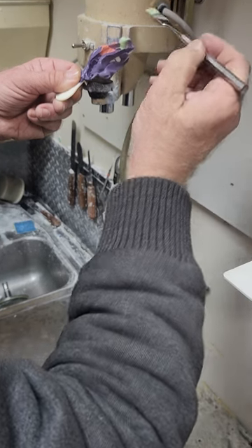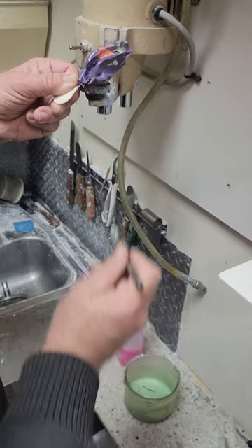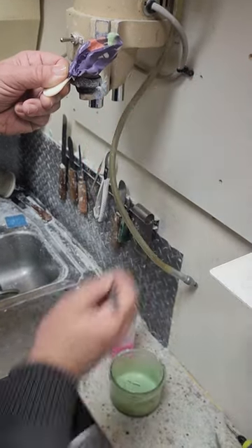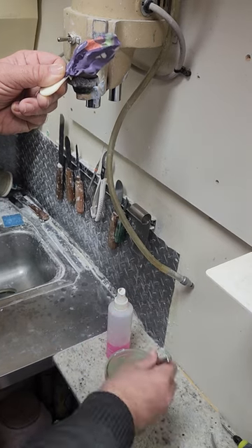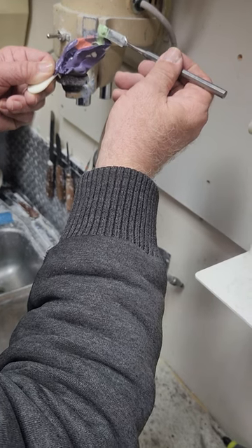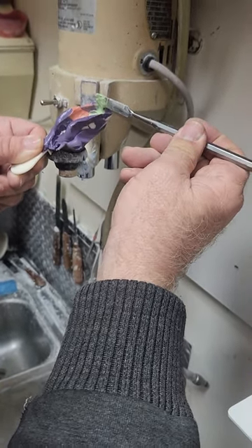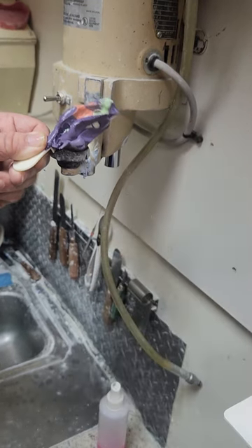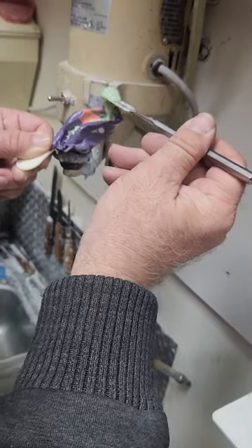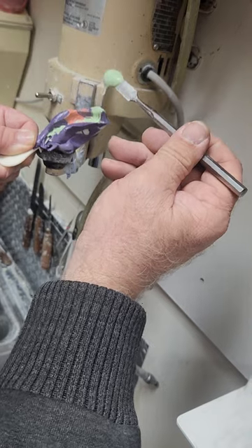It goes really, really slow and doesn't trap any bubbles. Let it just kind of work its way over. Notice that it moves fast if I hold it here — it creates a surface tension that slows down how fast the stone goes. Notice over here it's slowly filling in. When we drop it, there's no more surface tension and it flows faster.